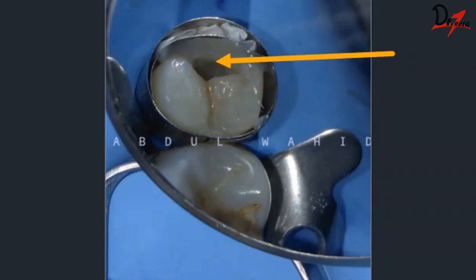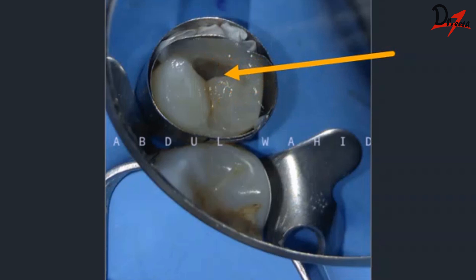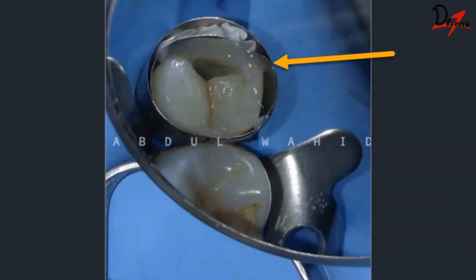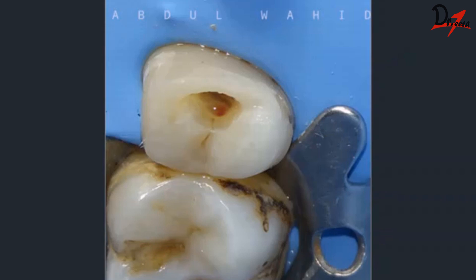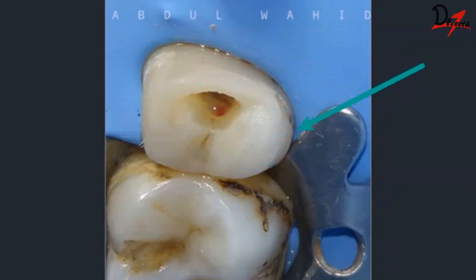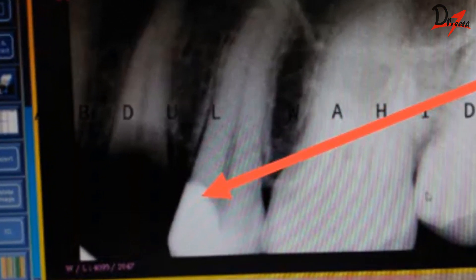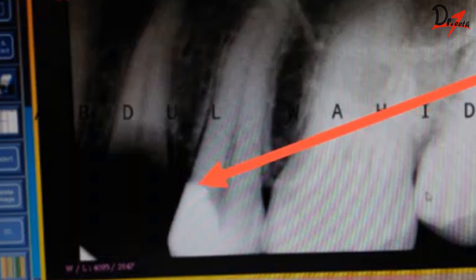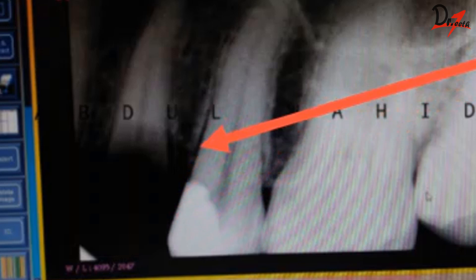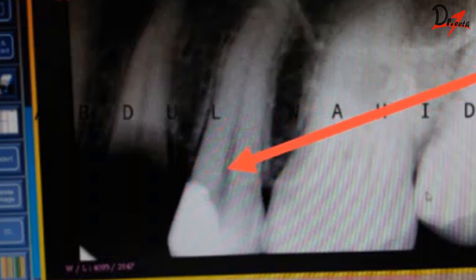When you have four walls, you have a proper cavity or chamber that holds sodium hypochlorite during your procedure and also retains your temporary filling while the patient is away between appointments. Here, the access opening was completed, the canal orifice is visible — marked with the red dot — and the pre-endodontic buildup with composite is shown. This radiograph confirms the matrix adaptation: if the composite is in line with the tooth with no overhang, it indicates your matrix technique was proper.